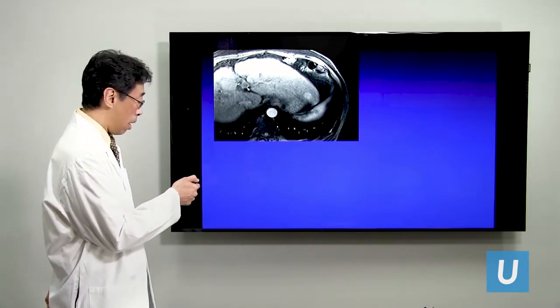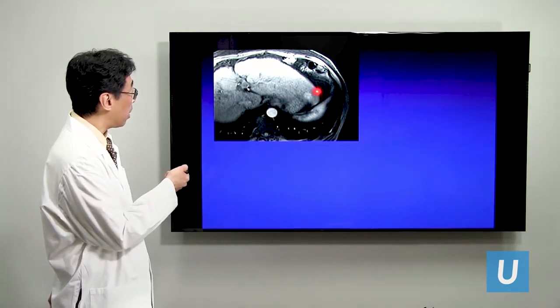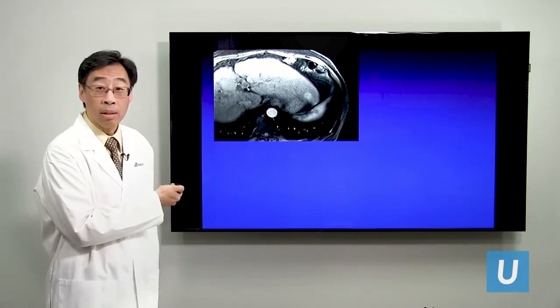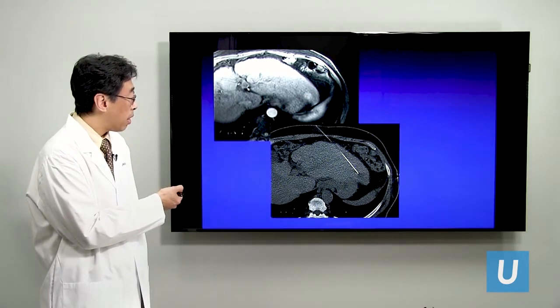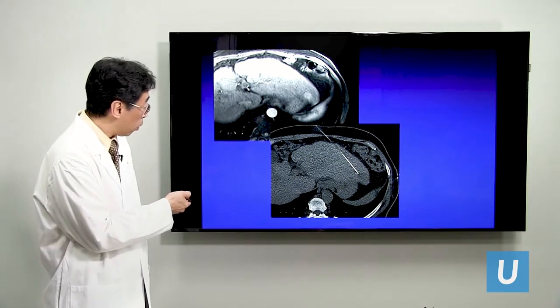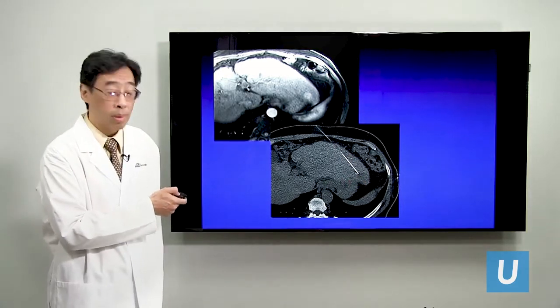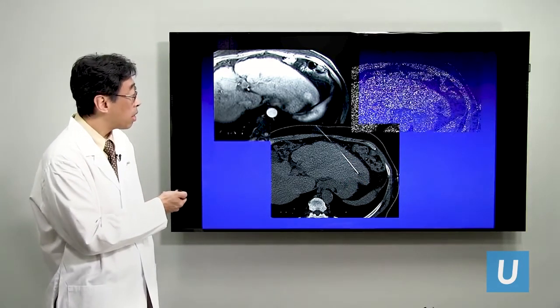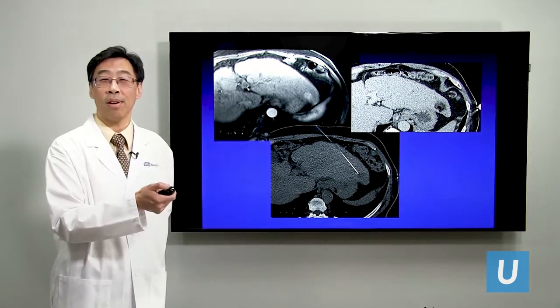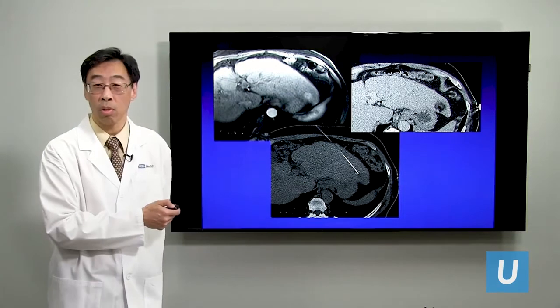This is an MRI showing a small tumor identified in the left lobe right here. And because we can see it, and we have dedicated tools that can access these small lesions, in this case, just a tiny needle that we can place precisely into the tumor. What we can do with that is, in this case, inject absolute alcohol, 99% proof alcohol, which will kill anything in its way, and in this case, has completely killed the tumor.